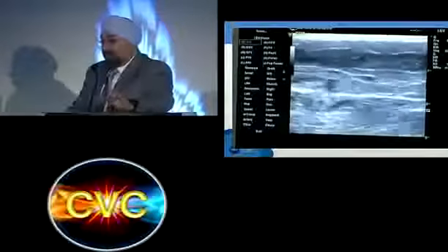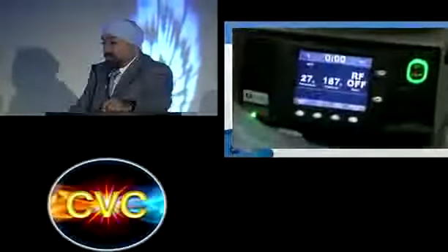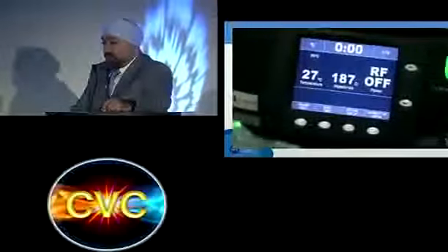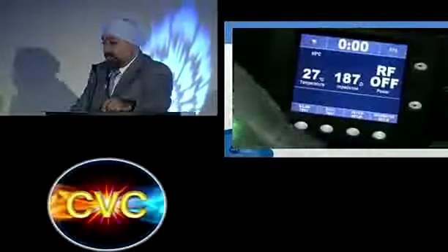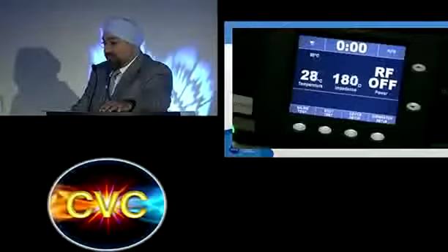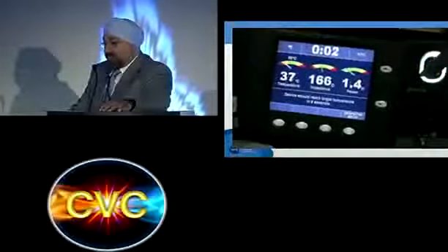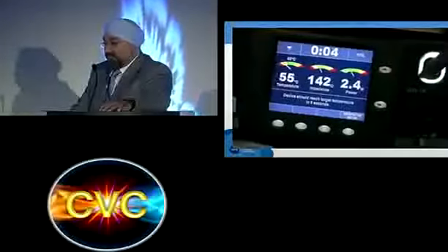That ultrasound. And one of the things that happens if you look at the RF generator below is as soon as I give that, the impedance drops further. And I know that I got adequate anesthesia around it. The assistant then presses on the RF power button. She keeps it on there in case the patient feels something, stop it right away.